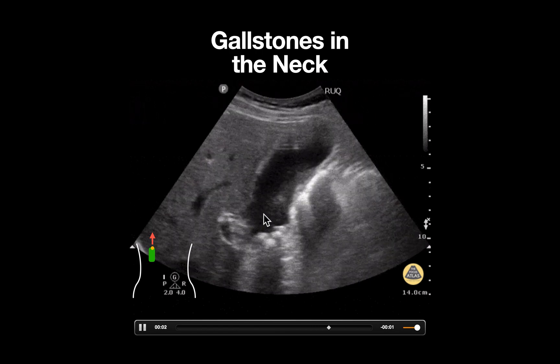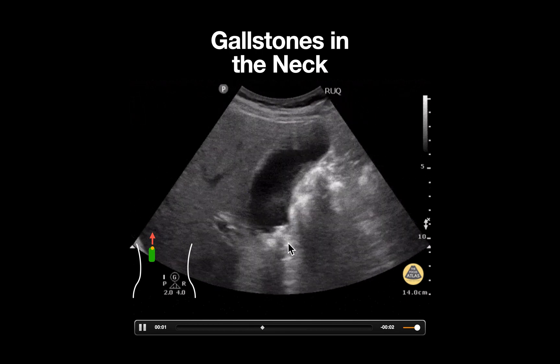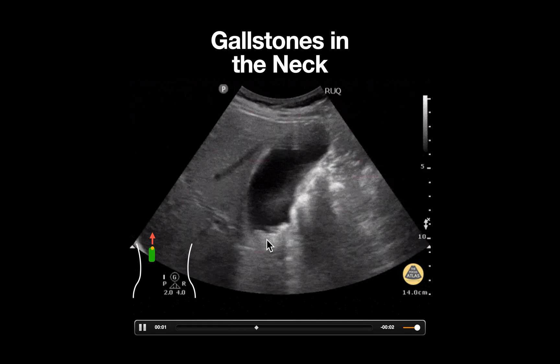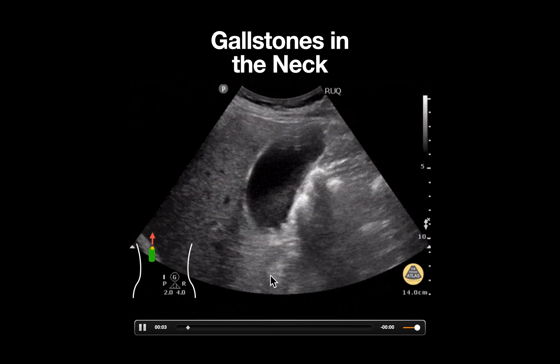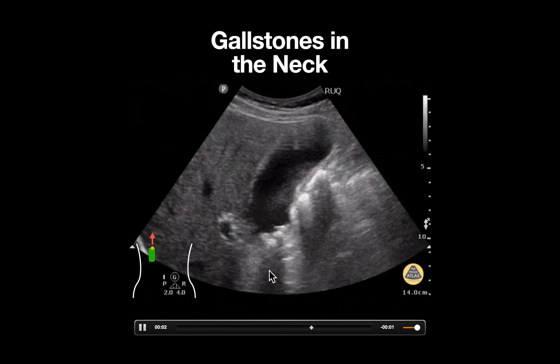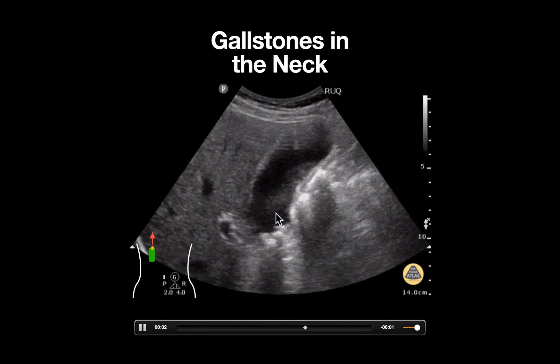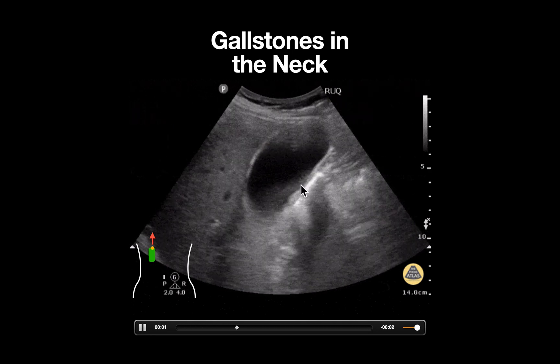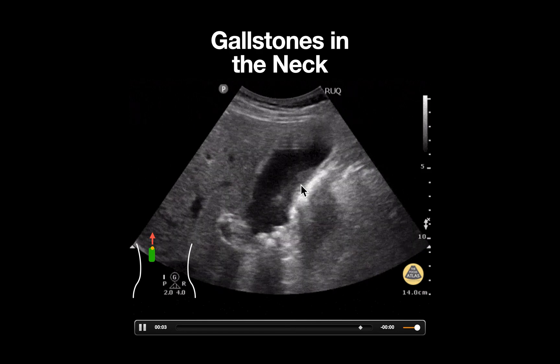However, as the probe is fanned, notice that in the neck we see several hyperechoic structures with associated posterior shadowing, consistent with gallstones. There is also an area which appears hypoechoic, likely consistent with biliary sludge.